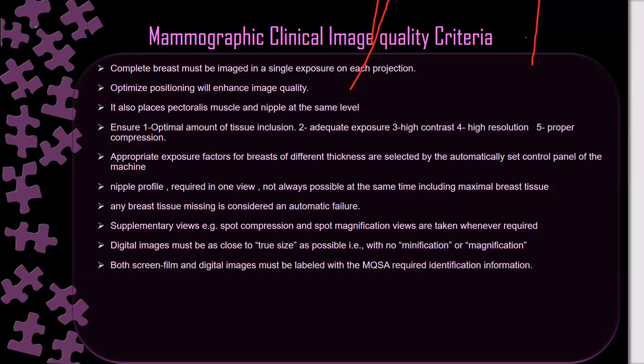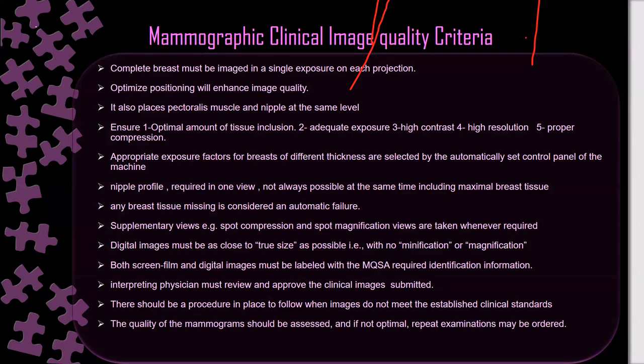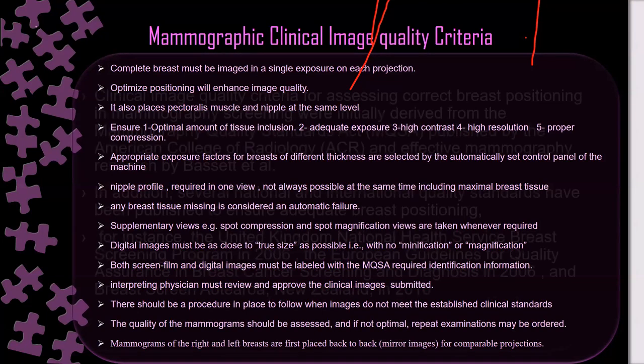Both screen film and digital must be labeled with MQSA required identification information. The interpreting physician must review and approve the clinical image submitted, and there should be a procedure in place to follow when images do not meet the established clinical standard. The quality of the mammogram should be assessed, and if not optimal, a repeat examination may be ordered. Mammograms of the right and left breast are placed back to back and should be a mirror image for comparable projections.